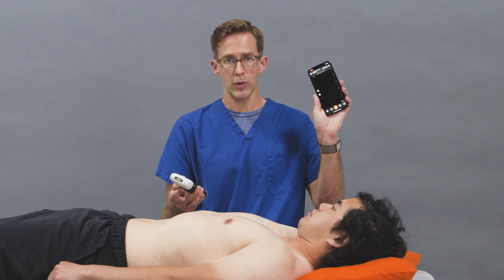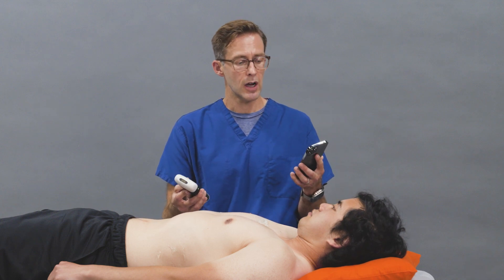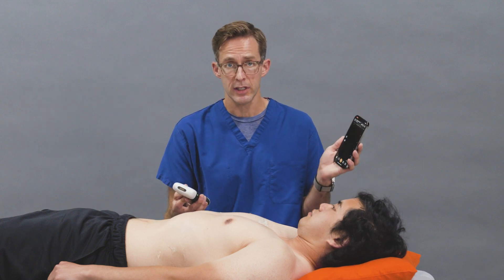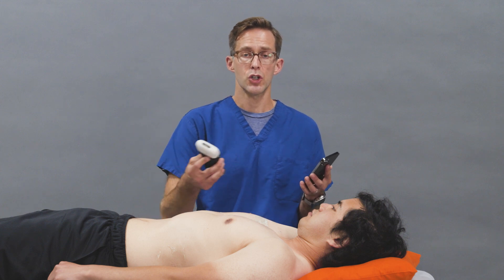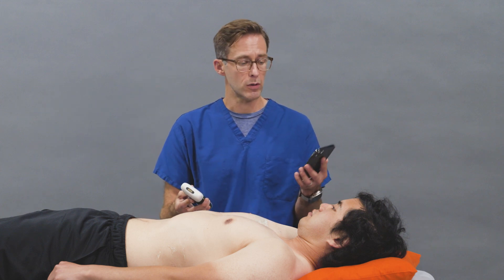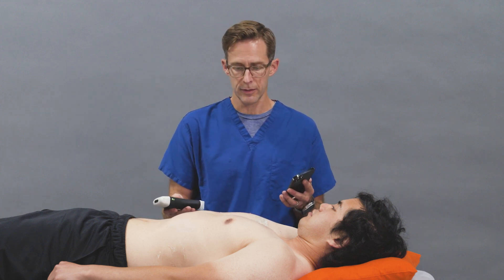In Clary's app, you're going to have your lung shallow preset. There's a lung deep and a lung shallow, so we're going to use lung shallow for pneumothorax.